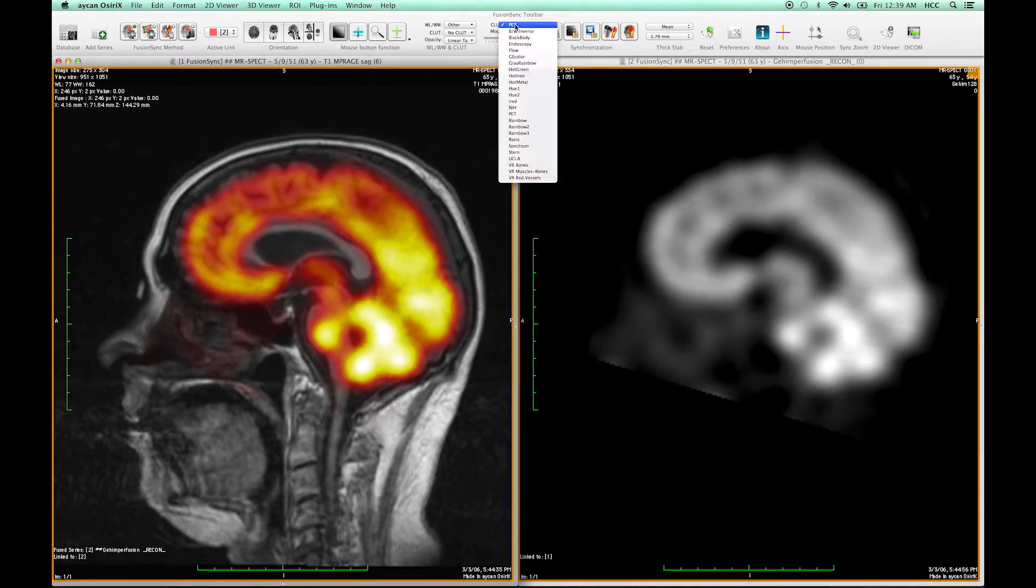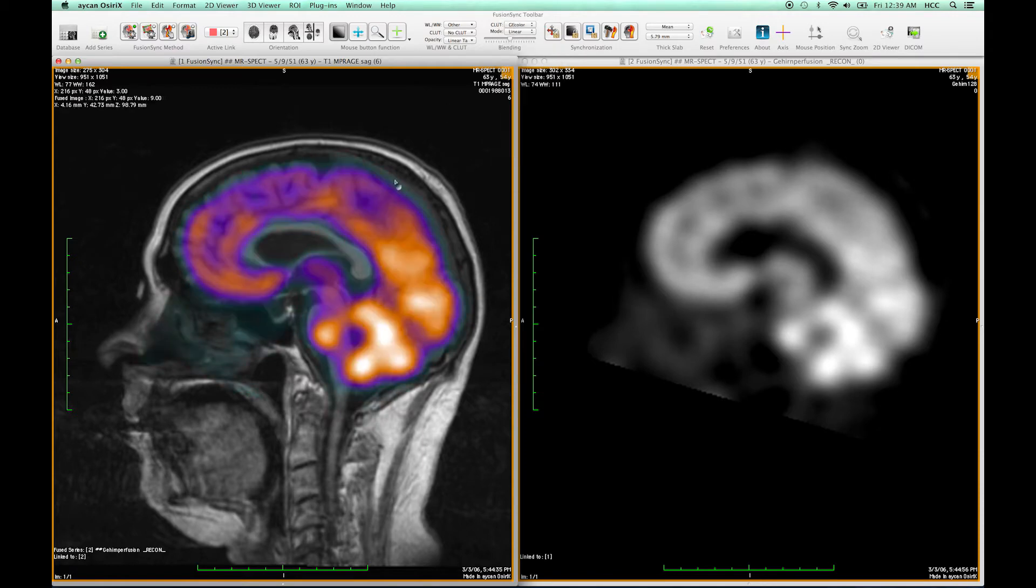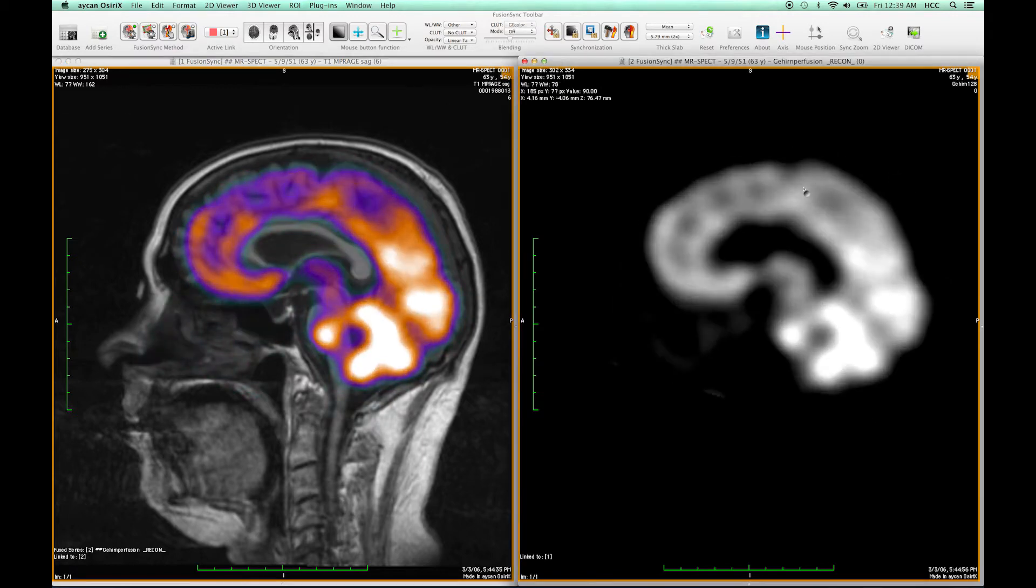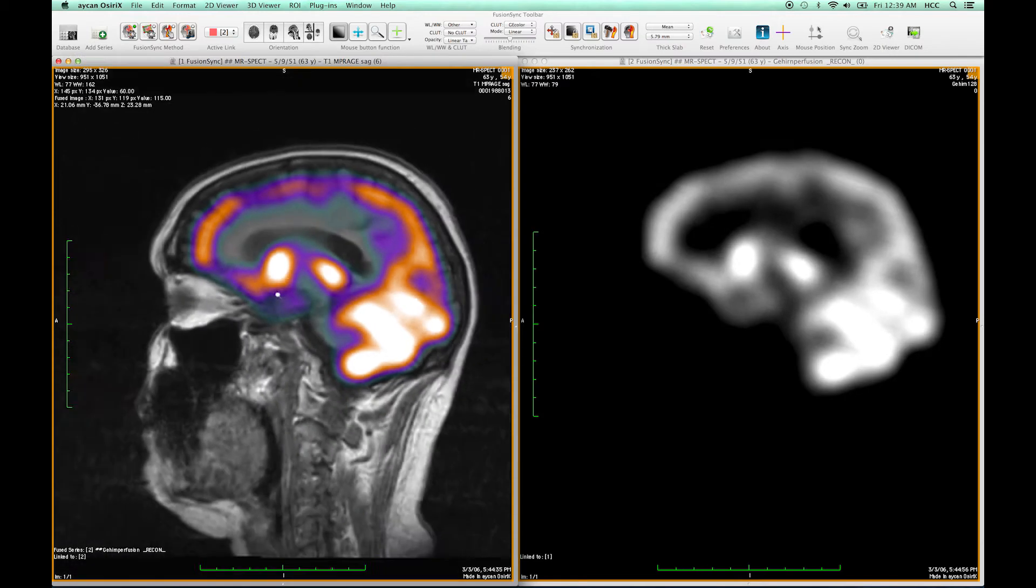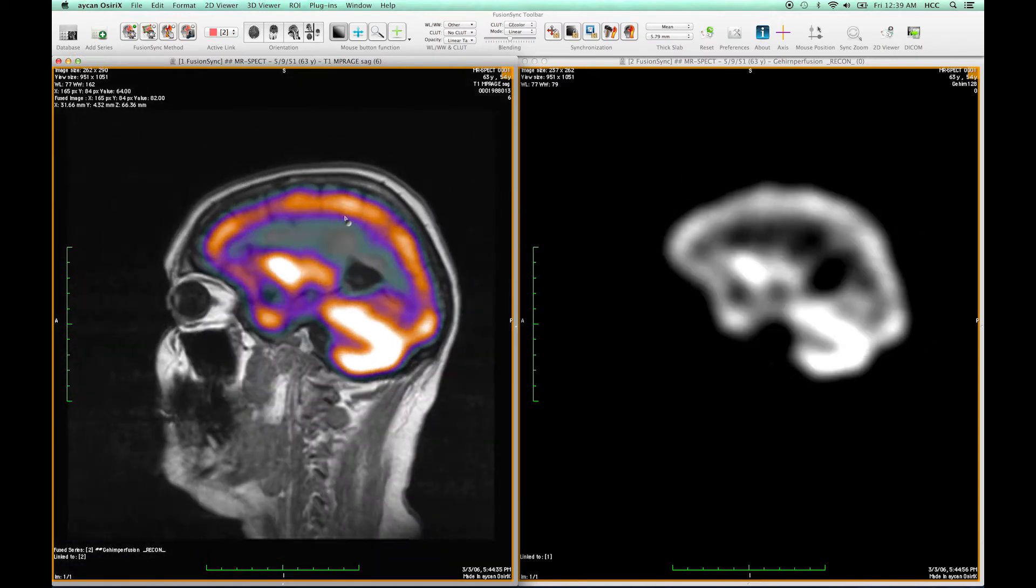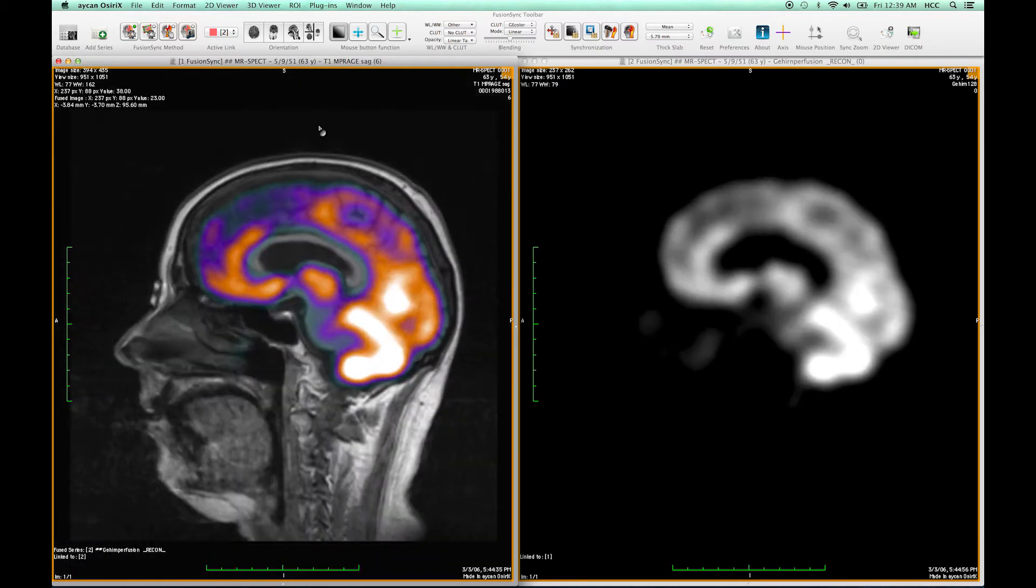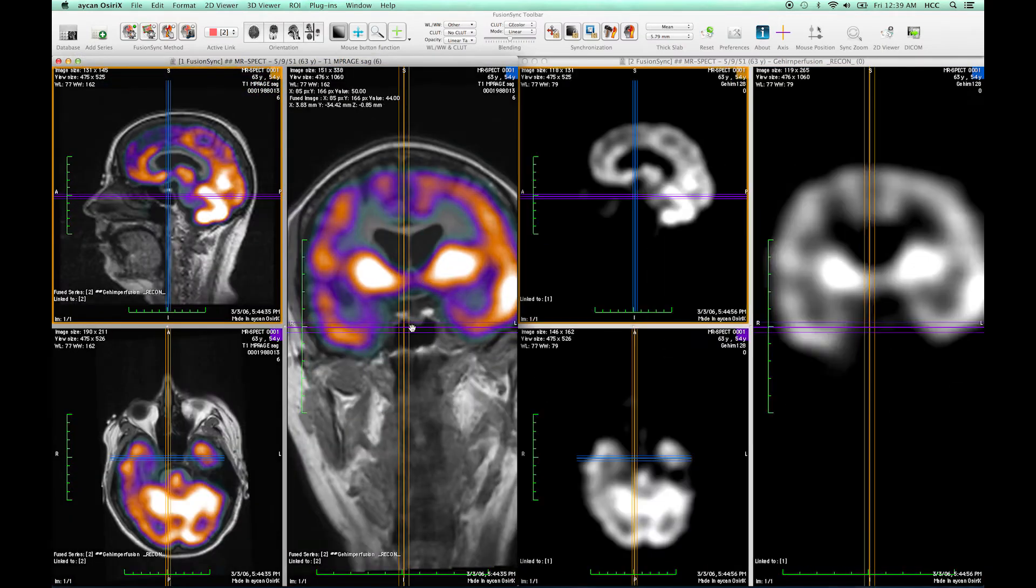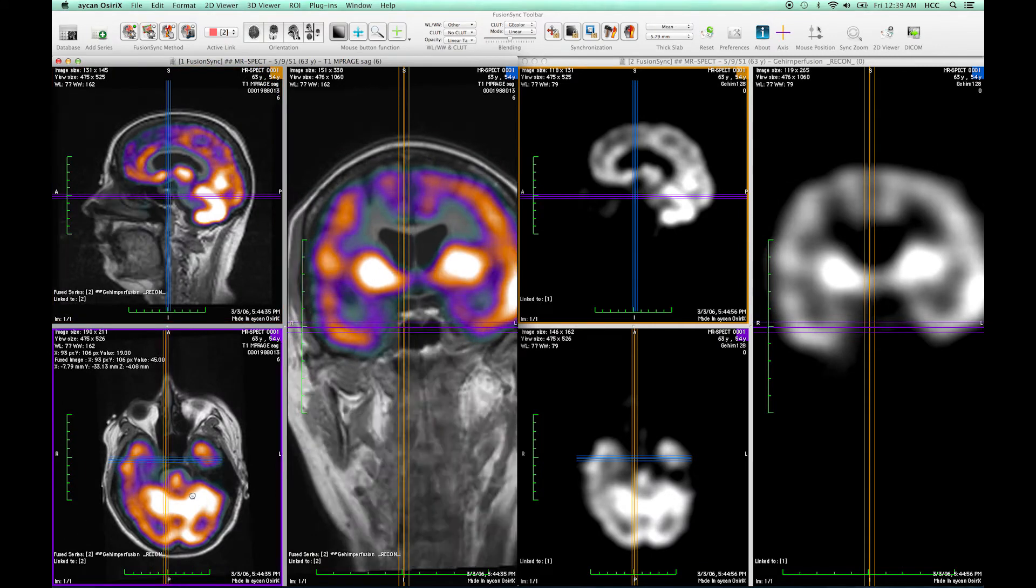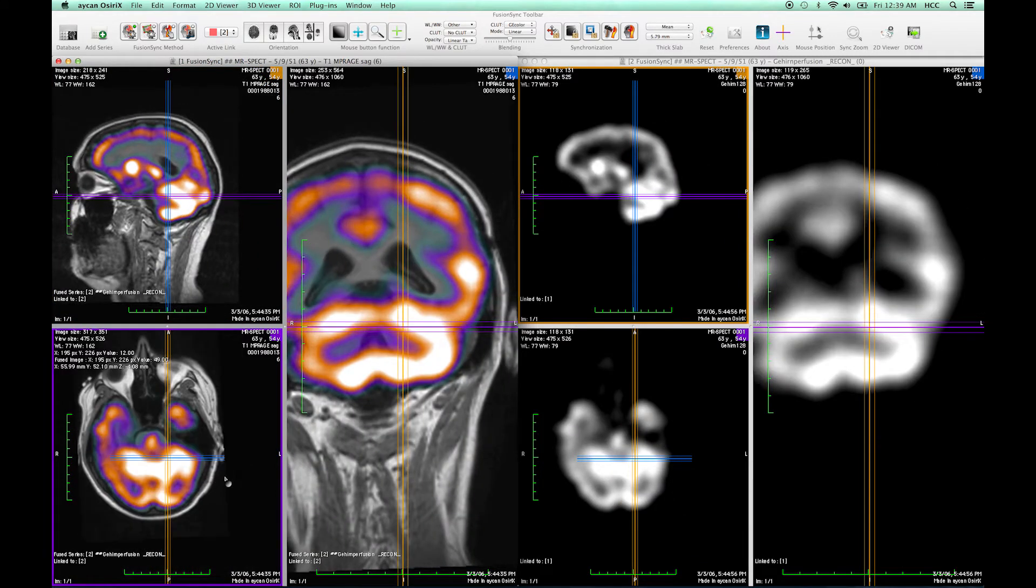And I can for example switch the color table and modify the view position, the zooming or switch the orientation. I can even do this in 3D and go to a specific part of the image.